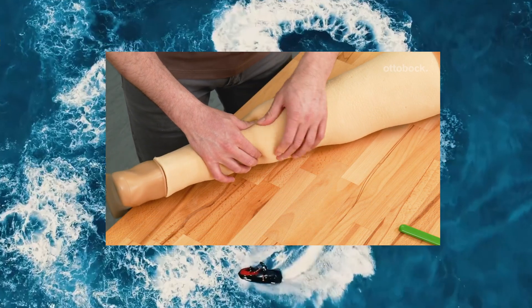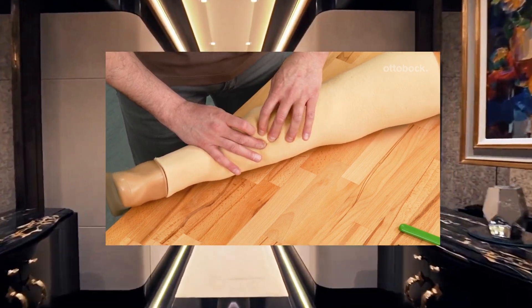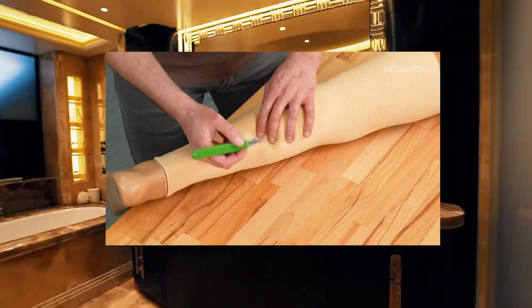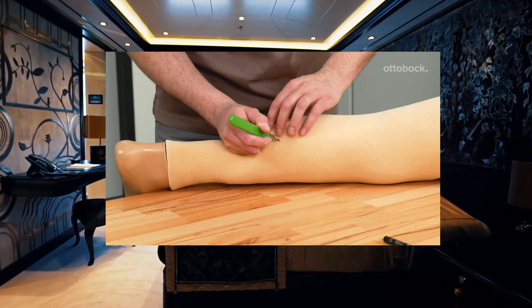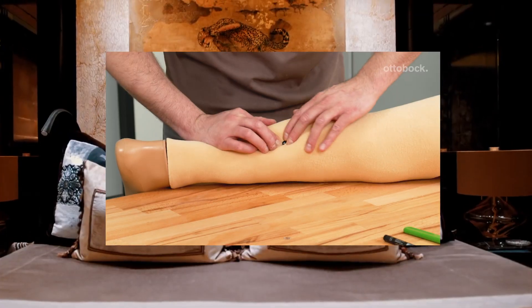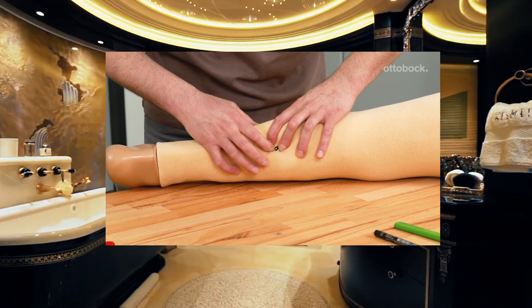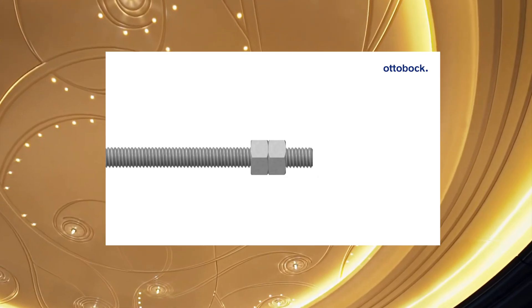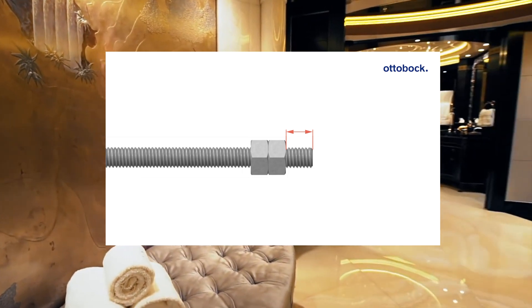Feel the area of the centering bore through the foam and create an opening. A scalpel can be used for this. Insert the centering rod into the centering bore with the end where the two nuts are placed. Do not remove these nuts, as they serve as a limit stop to protect the charging receiver.